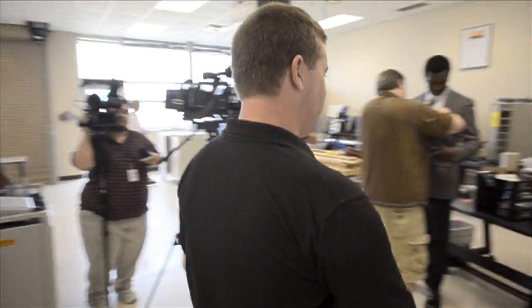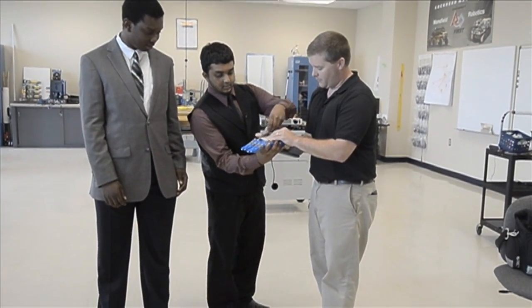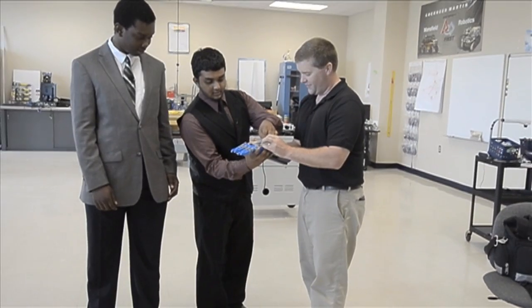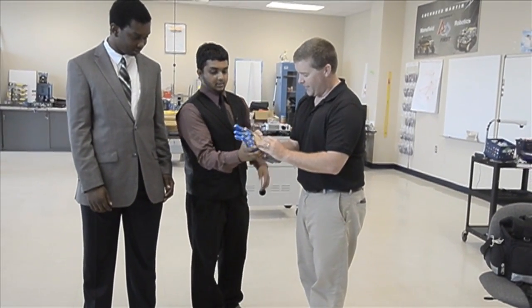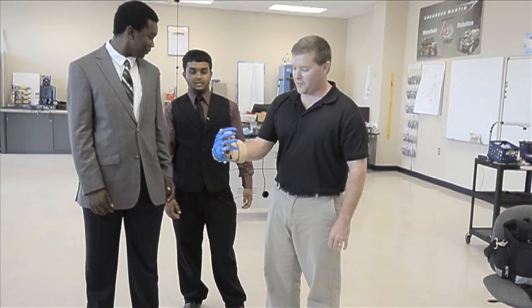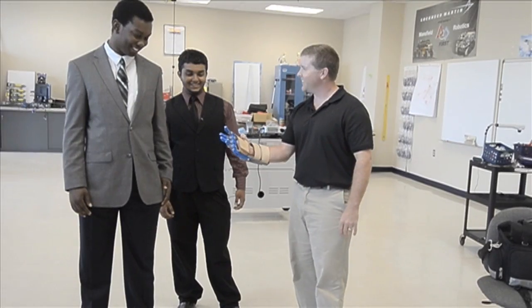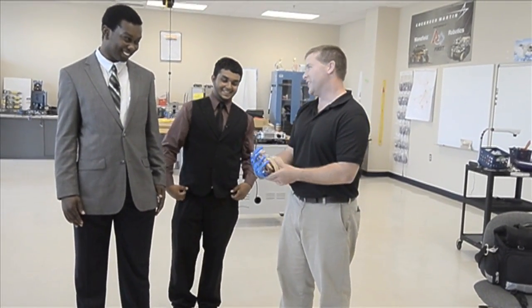We want to shake his hand first — it's nice to meet you. You guys even cut it out for the thumb, that's fantastic. From this point I'm able to have articulation for fingers I didn't have before. You guys did a great job, really did.